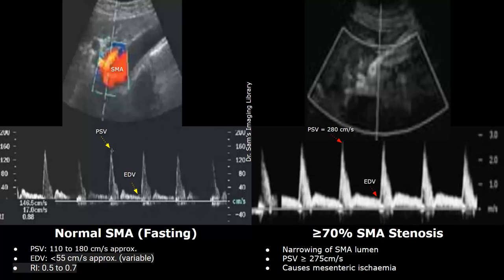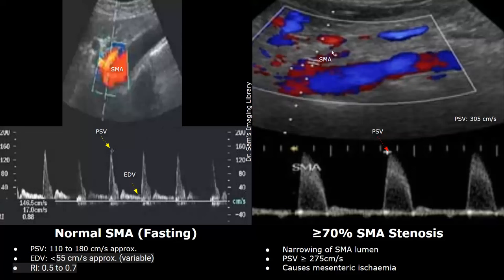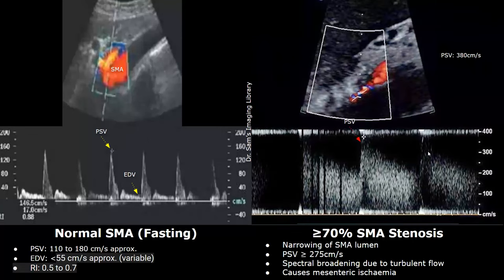Here is another image showing a greater than or equal to 70 percent SMA stenosis, with a PSV of 305 centimeters per second. This waveform is broad, usually due to turbulent flow. In another image, the PSV is 380 centimeters per second with spectral broadening due to turbulence. You can see mixing of red and blue colors at the sample volume, indicating turbulence. Such stenosis causes mesenteric ischemia.